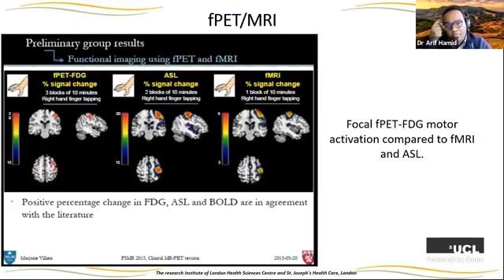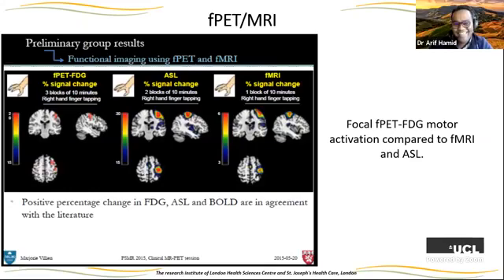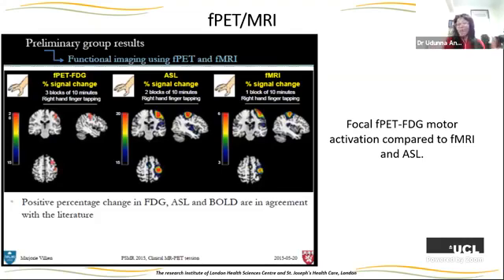Now there are fast approaches, so people are coming up with fast approaches to condense that time using deep learning. Deep learning to me, I'm still trying to figure out what it is. It sounds like voodoo. It works. We don't know how it works. But there are really good approaches that people are trying now with deep learning to minimize some of the confounders, motion being one of them, because it's very sensitive to motion. So if there's any difference between head motion, or even physiological motion, breathing patterns and stuff, between one paired experiment and the next, it can affect your signal or your SNR, your signal to noise ratio. So people are working on ways to compensate for that.